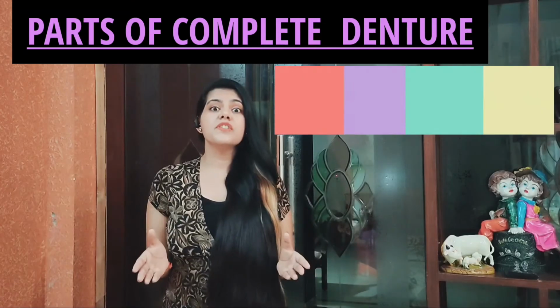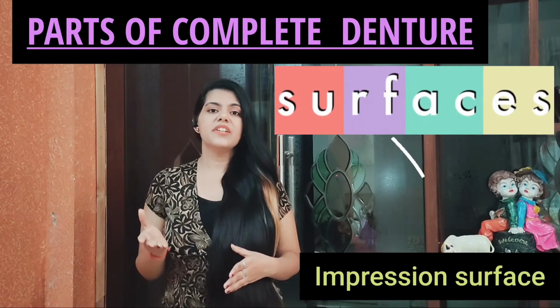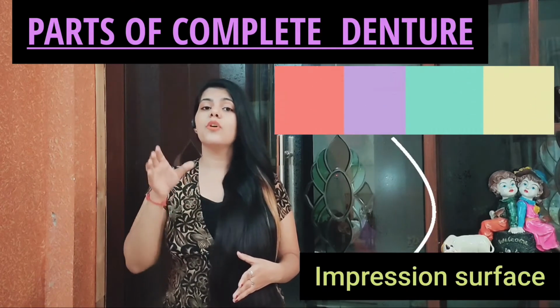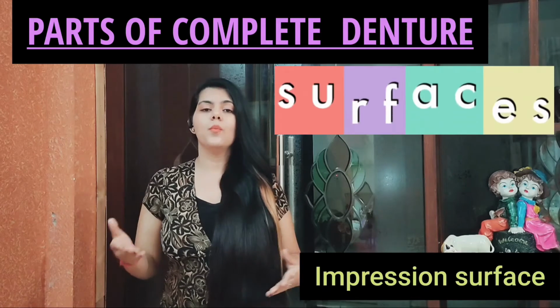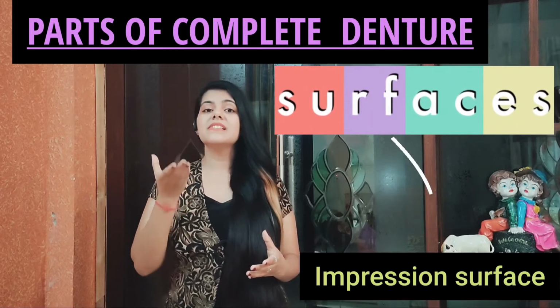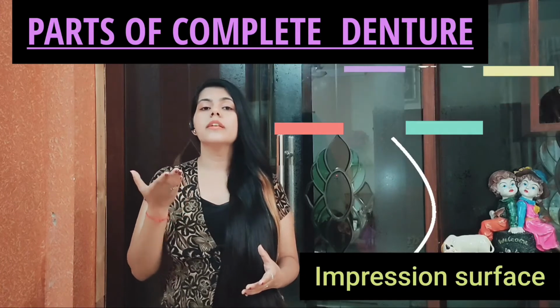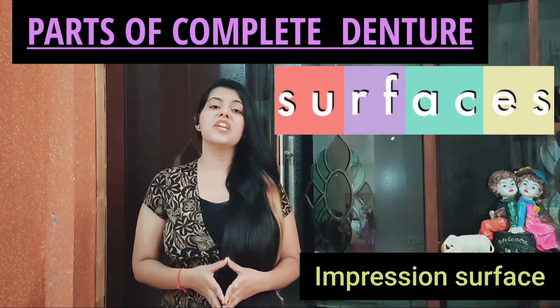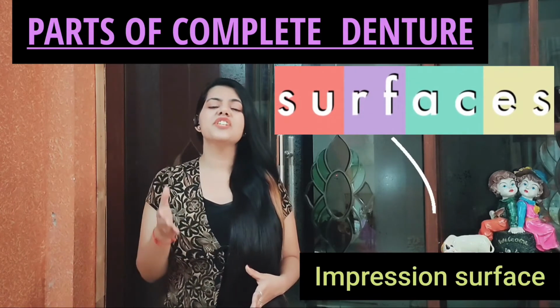So begin with the impression surface. It is also known as intaglio surface, and it is defined as that portion of the denture which has its own contour which you can differentiate while taking the impression. It is actually the basal part or the basal seat of the denture which sits over the tissue of the oral cavity. It is also the negative replica of the tissue present in the oral cavity. Any kind of voids or nodules can lead to tissue injury.